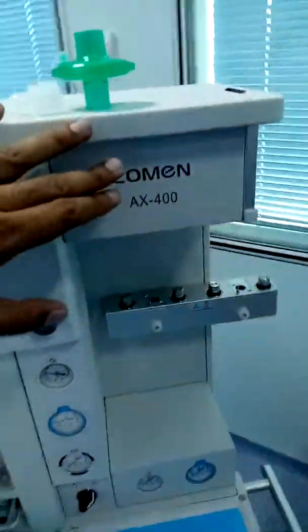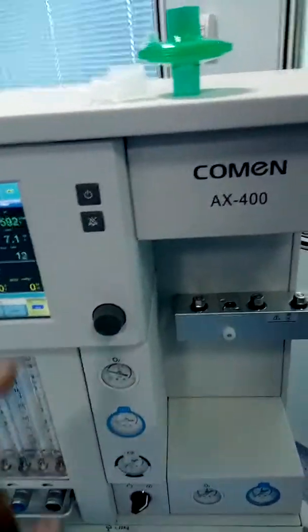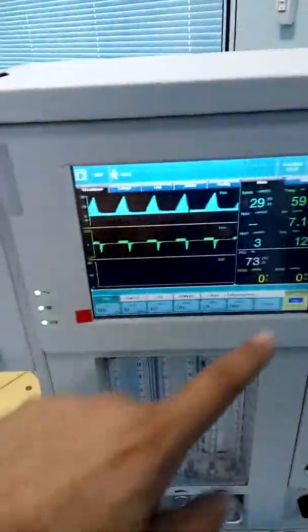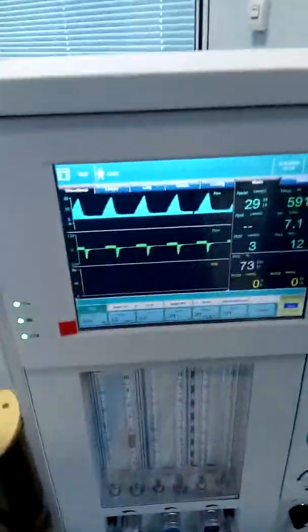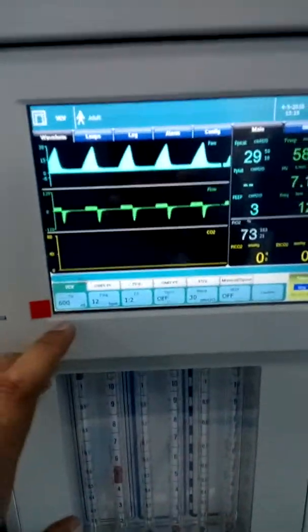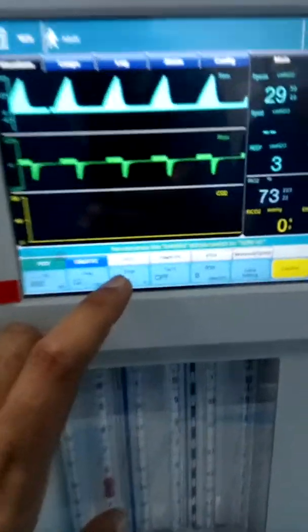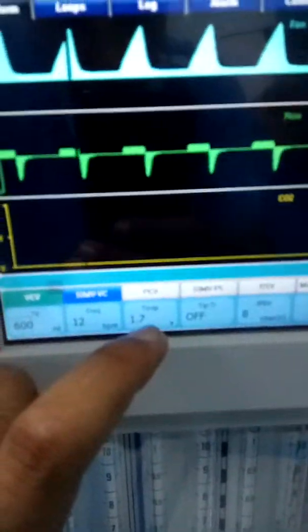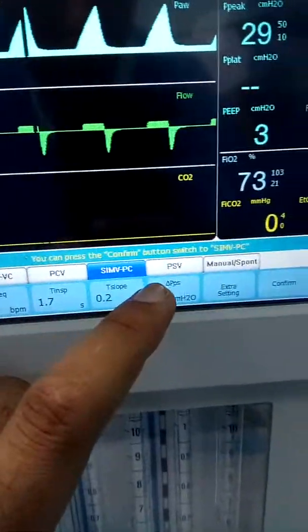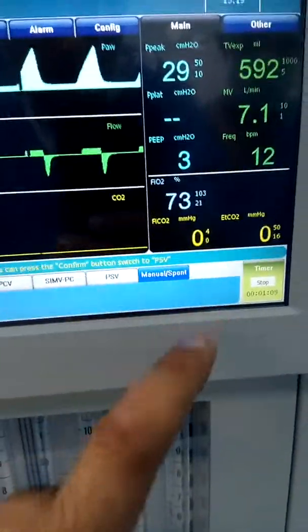This is the AX400 machine. I have covered the entire features of the machine in my previous video. In this video we are going to discuss the ventilator. In this ventilator we have volume control, SIMV volume control, pressure control, SIMV pressure, pressure support ventilation, manual, and spontaneous modes.